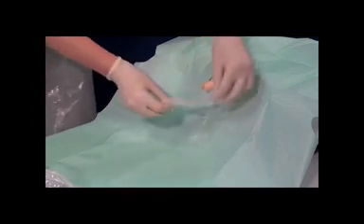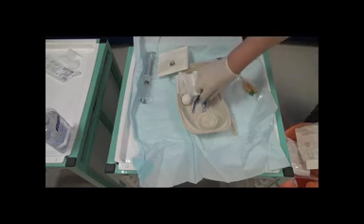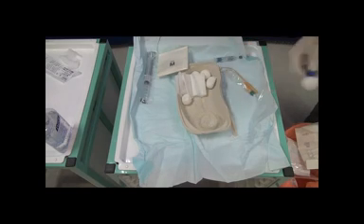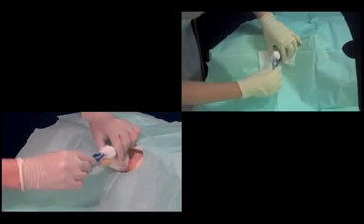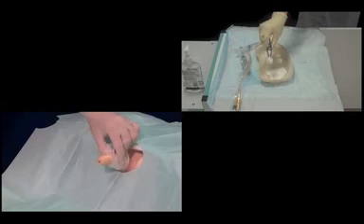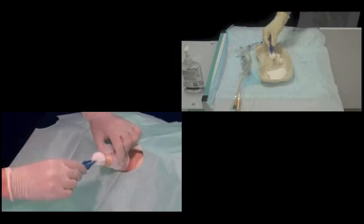Take some gauze and create a sling, or hold the labia apart, and then take your cotton wool and clean around the area. Repeat this procedure using a new piece of cotton wool each time until the area is thoroughly clean.